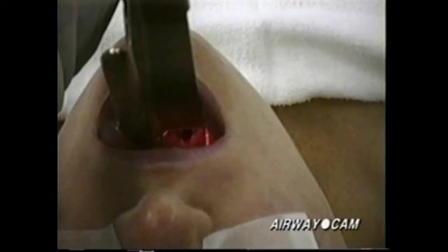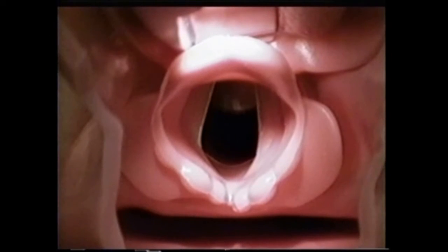Following visualization of the posterior pharynx, one of 2 critical landmarks should come into view, either the epiglottis, shown here, or the posterior cartilages, as shown in this patient. Note that above the posterior cartilages and interarytenoid notch is the entrance into the larynx. Below the posterior cartilages is the esophagus. If the true vocal cords are not visualized, directing the endotracheal tube anterior to these landmarks will ensure endotracheal placement.